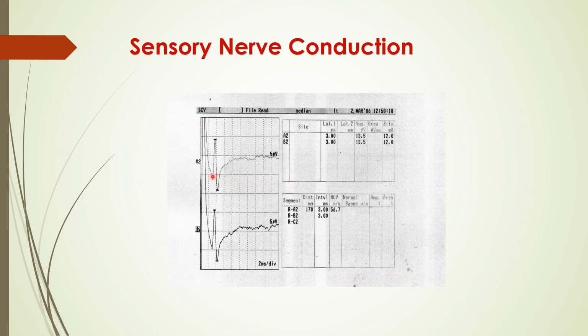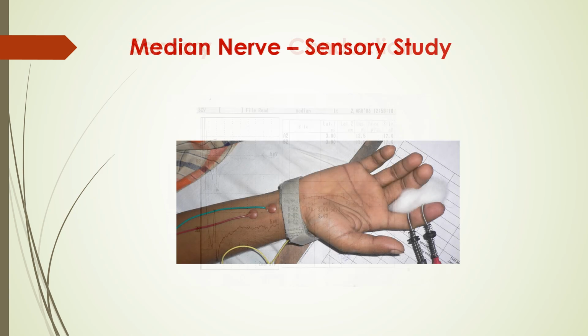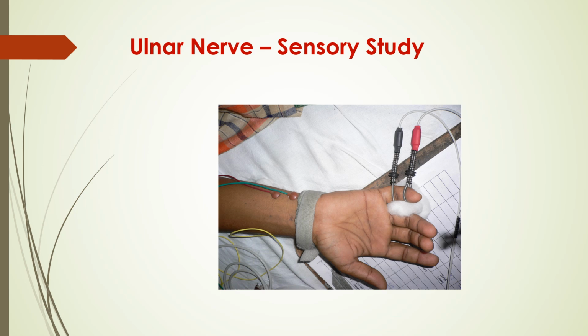So this is the way we record: we stimulate the nerve, calculate the latency, calculate the distance, and arrive at the nerve conduction velocity in sensory nerves. Median sensory study in action, ulnar nerve sensory study in action.